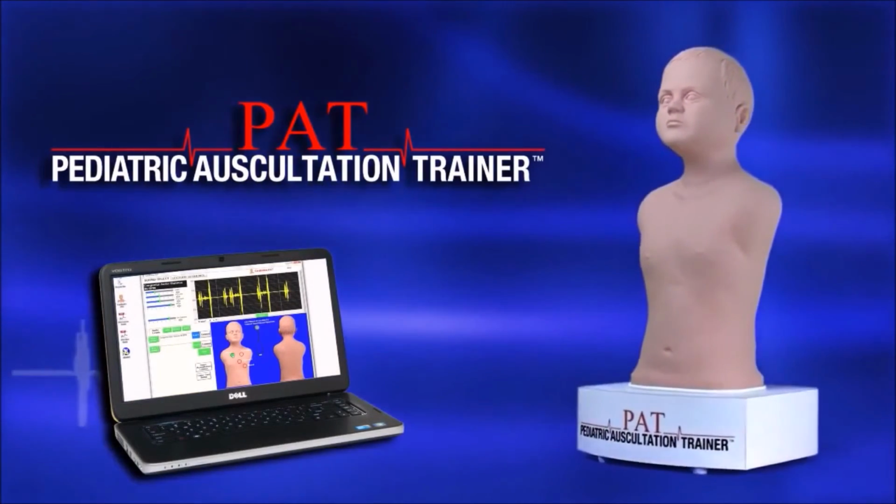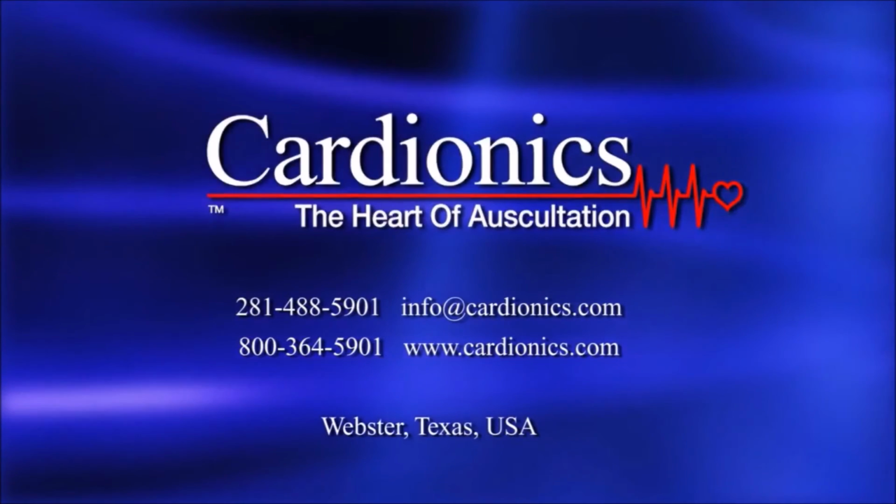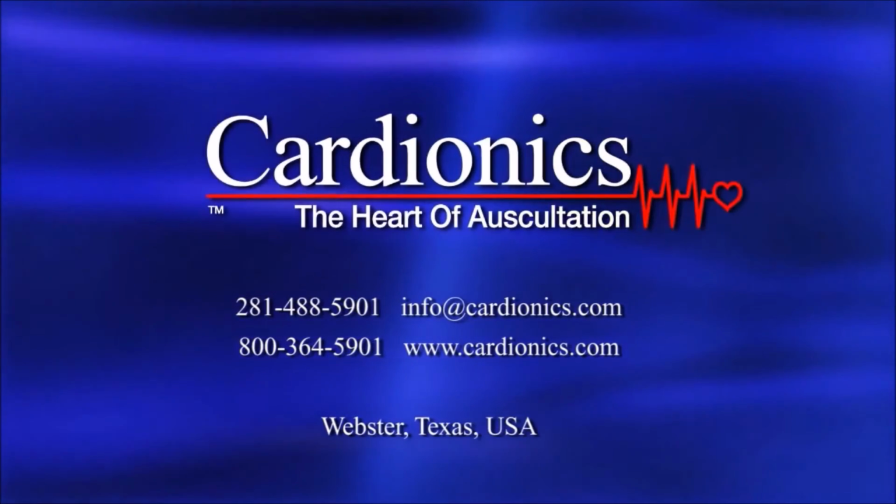This concludes the setup of PAT. If you have any further questions, contact Cardionics at 1-800-364-5901.